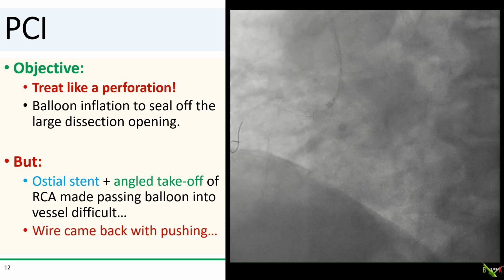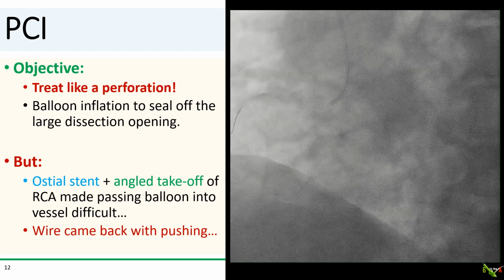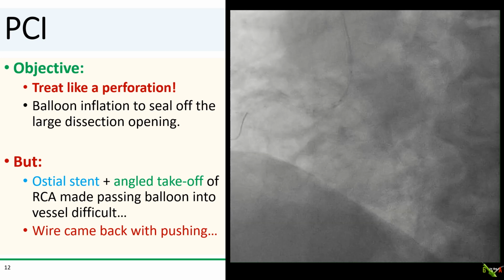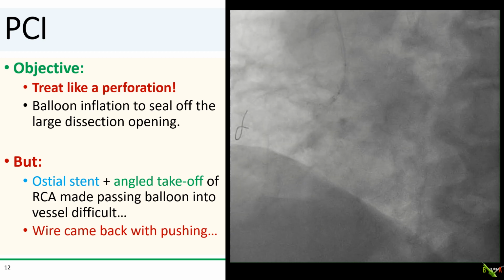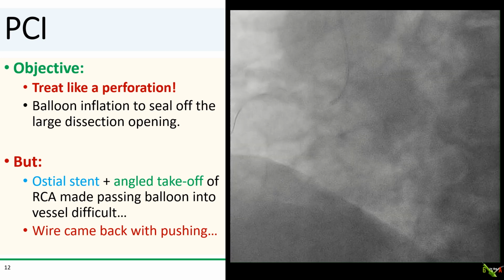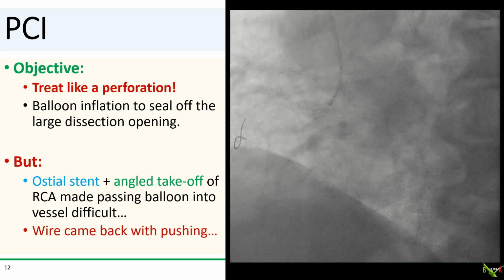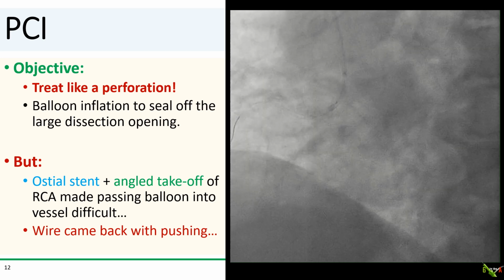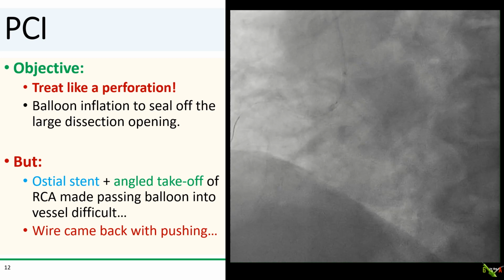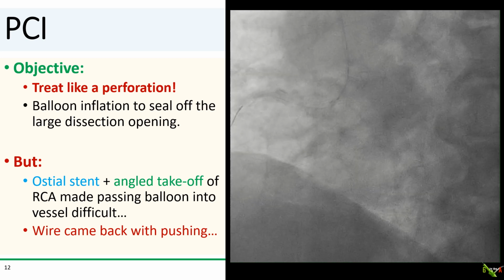So if we're essentially dealing with a perforation from the RCA into the false lumen of the aortic wall, we decided to treat it like a perforation. And the first thing to do is to balloon tamponade it off. But with the freshly placed ostial stent hanging out into the aorta, the angled shepherd's crook, and the minimally supportive FFR wire that we had, we had a really tough time passing a balloon back into the RCA.